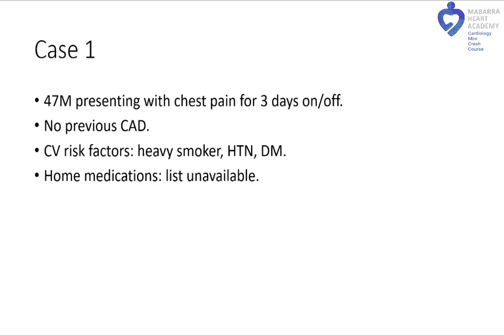However, in most cases, you may have critical stenosis, so it may be difficult to deliver the IVL balloon because it's also very bulky. In this scenario, we'll just move on with this case.